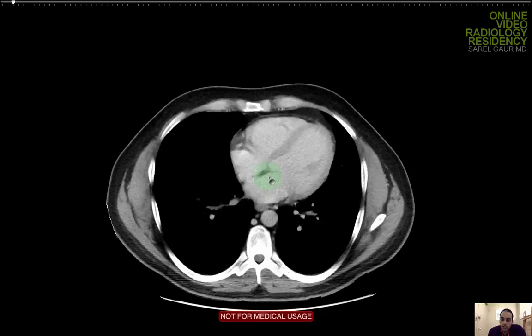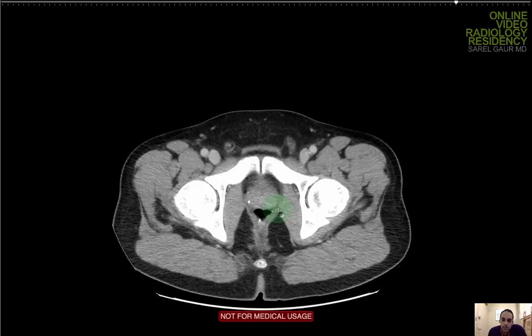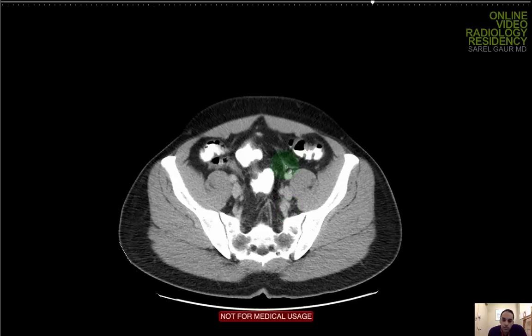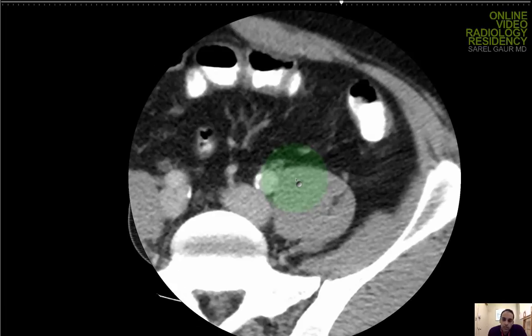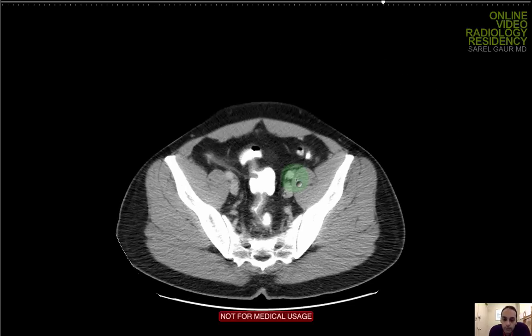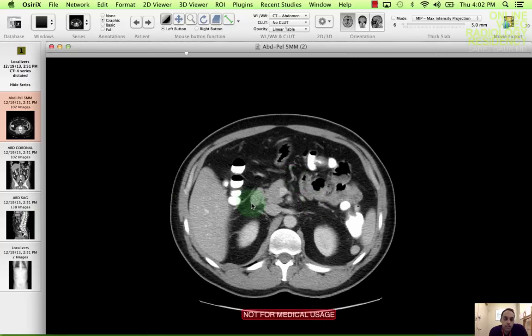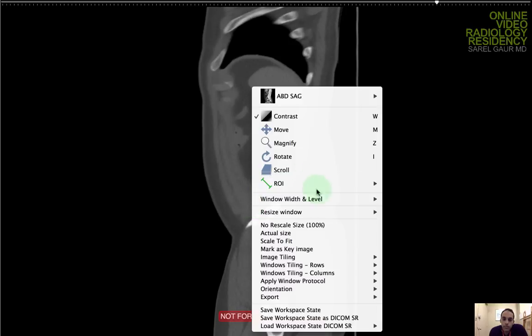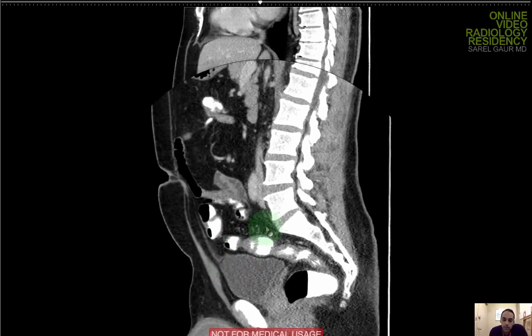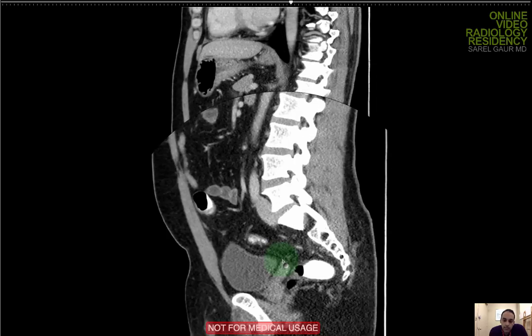Now I'm looking for free fluid or free air. Coming down to the pelvis — I want to see if free fluid is layering within the fat of the peritoneum. I can see just some trace free fluid here — this triangular-shaped free fluid. That's normal to have a small amount. We're looking for a large amount, which would suggest something like perforated bowel or significant inflammation. You can also look in the sagittal plane, which shows free fluid very nicely — layering within the pelvis, above the bladder, behind or in front of the bowel loops. Just run the dependent portions of the abdomen to make sure you're not missing any free fluid.